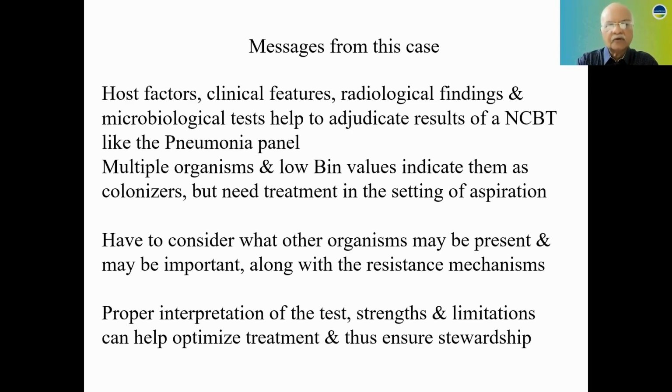So the messages which come out from this case are certainly host factors, clinical features, radiological findings, and a microbiological test. All of them can help to adjudicate the results of a non-culture based test such as the pneumonia panel. Now you had multiple organisms there, 2 or 3 gram positive and gram negative, but all of them had low bin values.